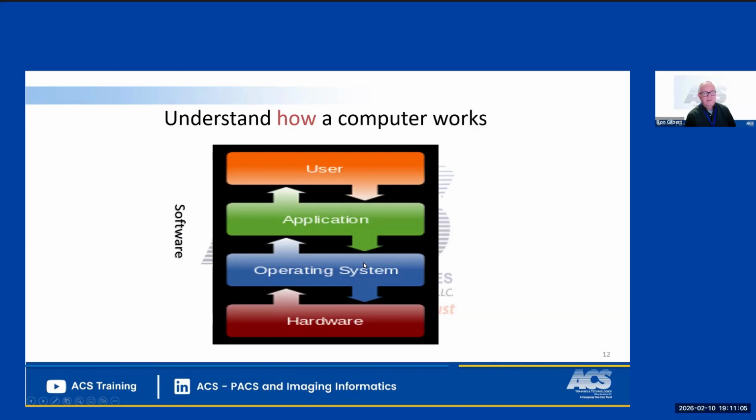And then hardware, if your hardware doesn't work, you're not seeing any of this. And then what could possibly be a user error or a user issue? That is something a technologist or somebody will call you up and say, I can't get into the PACS, or I can't do whatever. You have to listen real carefully and find out what they're telling you, because they give you great clues.